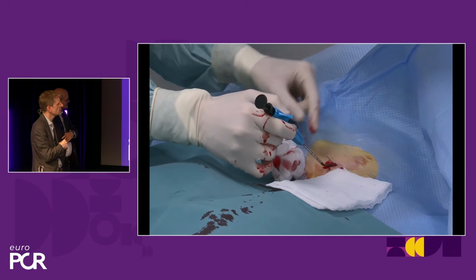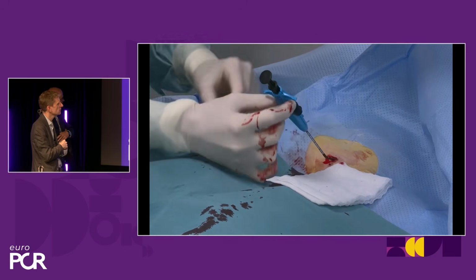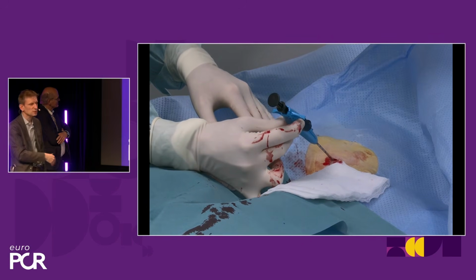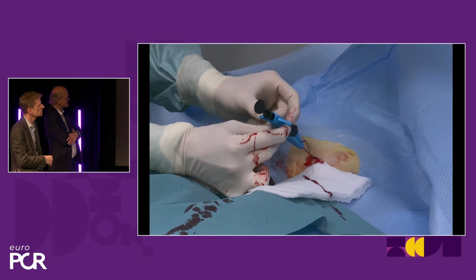Now we pull back on the wire. And then we introduce it further. I'm working here apparently on the left side of the patient, which is not my routine. So here you see the bleed back.